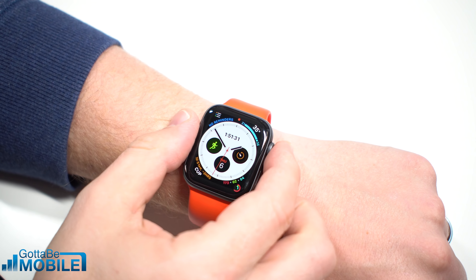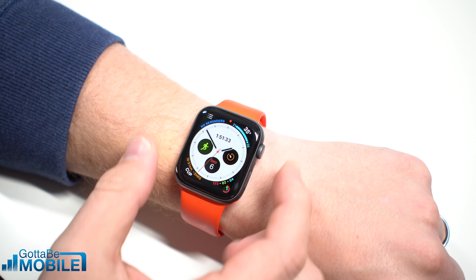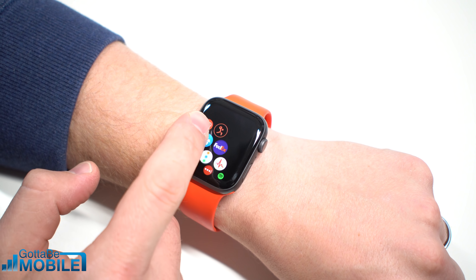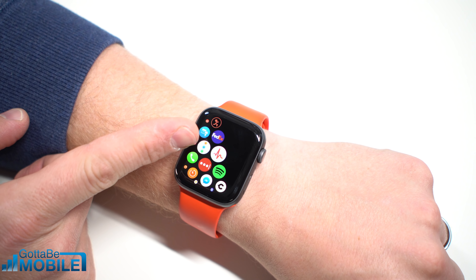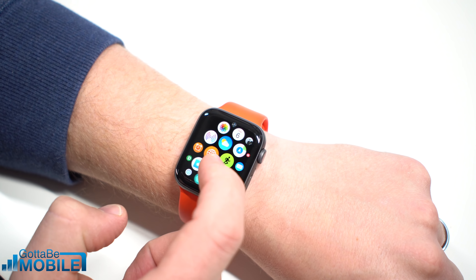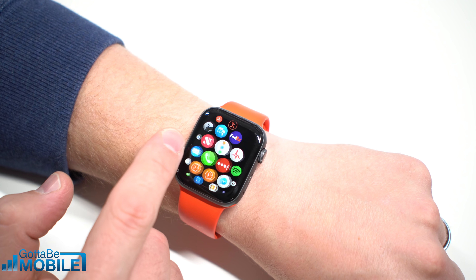I'm Josh Smith with GottaBeMobile.com. I'm going to show you how to take an ECG on your Apple Watch Series 4. The first thing you need to do is go to your Apple Watch, push on the side dial here, and this will bring up your apps. You're going to need to look for the ECG app, which is this app right here with a little heart rate indicator. It is different from the heart rate app that you've probably used before.